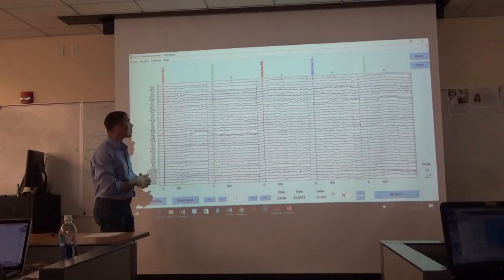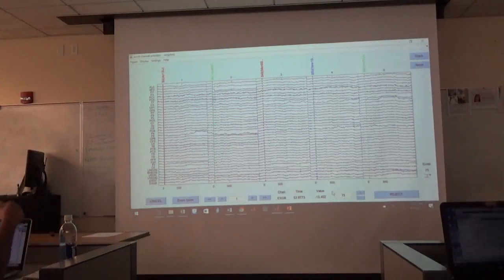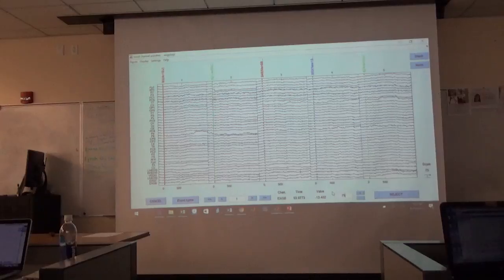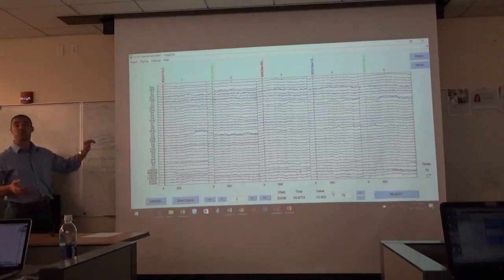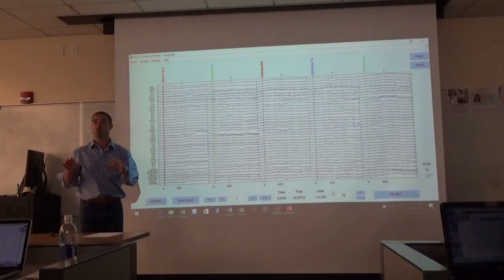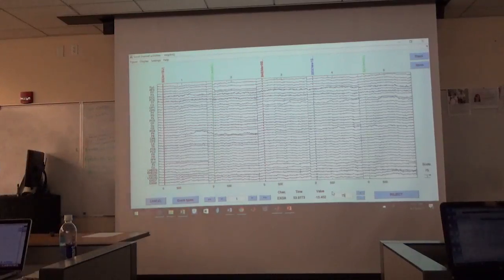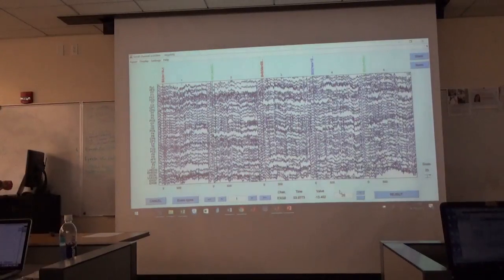And so, we're going to have our 300 trials, and let's navigate around here. When you go through and do your artifact inspection, when you're inspecting the data, make sure you set it to 75, because that's going to be a standard level that we can look at all the subjects with, and we'll be able to get a closer view. Because let's say that we zoom in, I'm going to get crazy here. I'm going to put 20 in just to show you guys. Wow, that looks really messy, right?